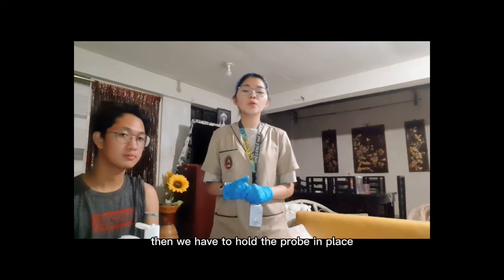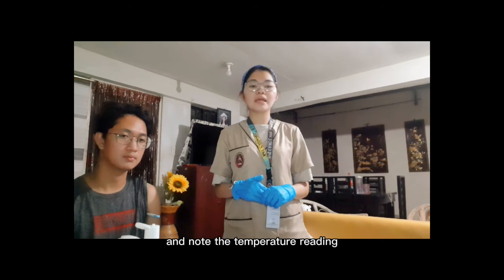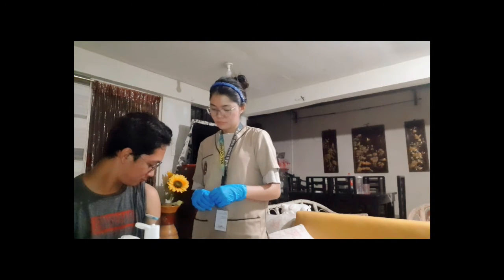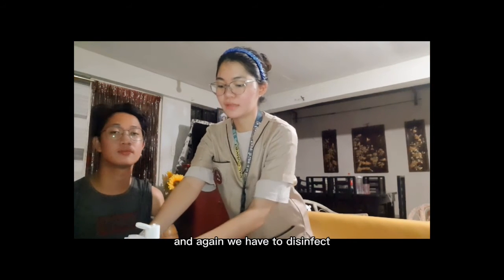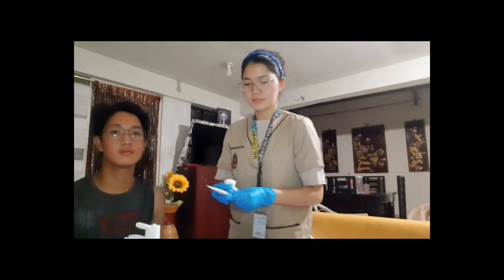Then, we have to hold the probe in place until we hear the beep and then carefully remove the probe and note the temperature reading. Then again, we have to disinfect the thermometer.